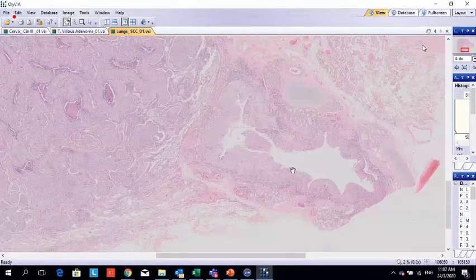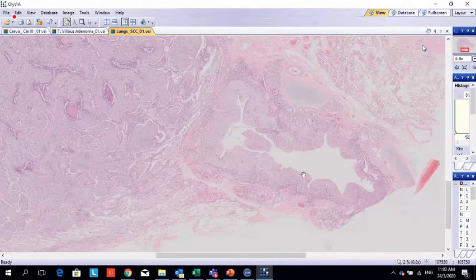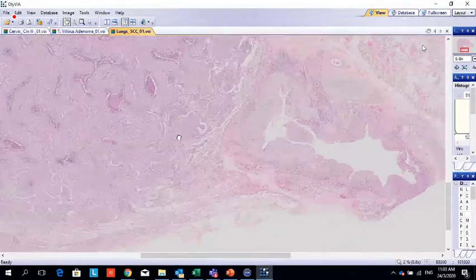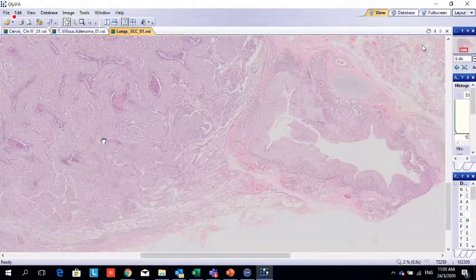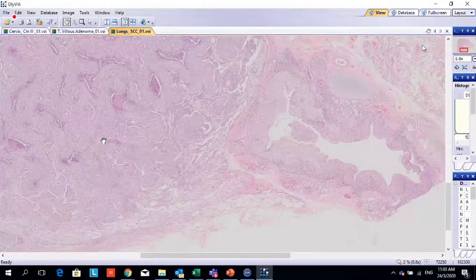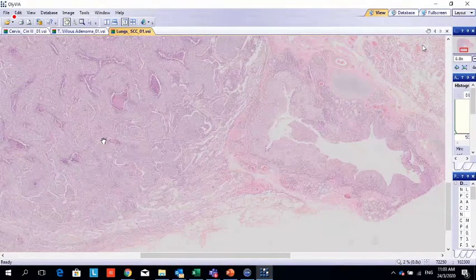Okay, name this condition: poorly differentiated squamous cell carcinoma of the lung, and focus of carcinoma in situ. Okay, explain the cell origin of this tumor. Cell origin from where? Dysplastic bronchus. Yeah, bronchial lining, which is undergoing squamous metaplasia due to the irritation of the chronic smoking, isn't it?